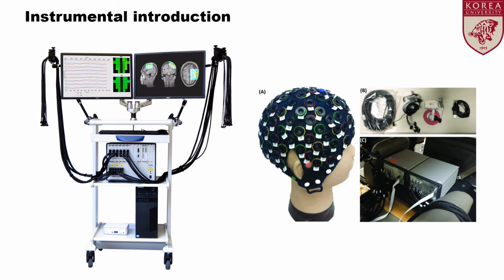Also here we can see the NIRS cap where the sources and detectors are placed on the skull. The researcher carefully chooses the optode configuration and prepares the cap according to the study design, and after preparing all the instrumentation, the data can be recorded.